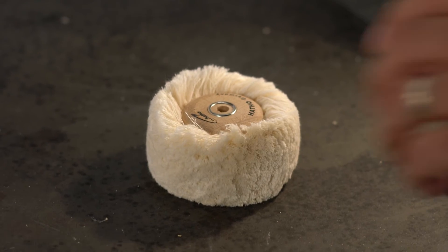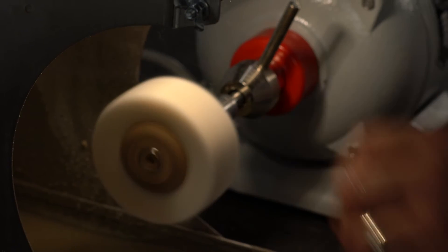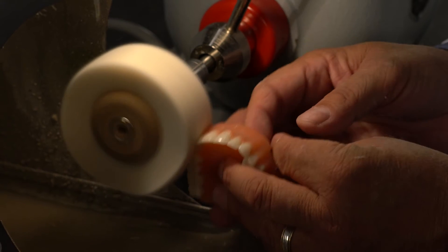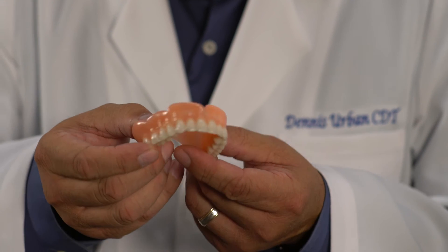For the last step, you'll use the cotton buff for high shining. Utilize this to bring about a high luster on the denture. Polishing is one of the most labor-intensive and time-consuming tasks in the laboratory, but with Hatho you can cut your time in half and get a better product.